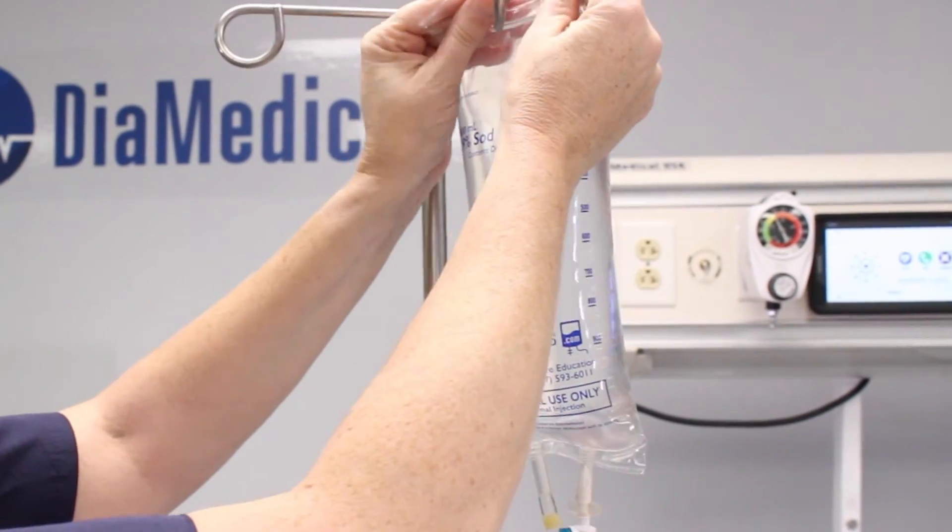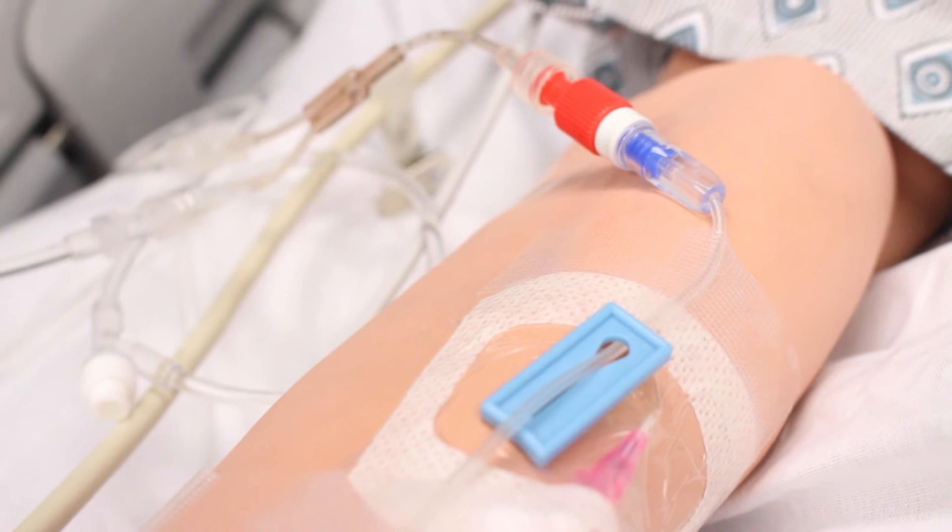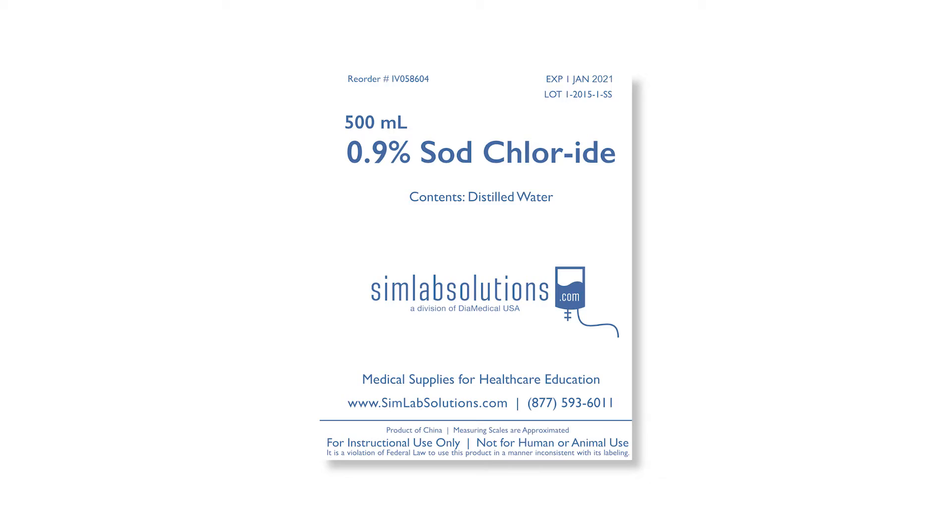However, they contain distilled water that will not damage tubing within mannequins and skills trainers. They also have warning labels to indicate that they are for educational purposes only and not for use with humans or animals.